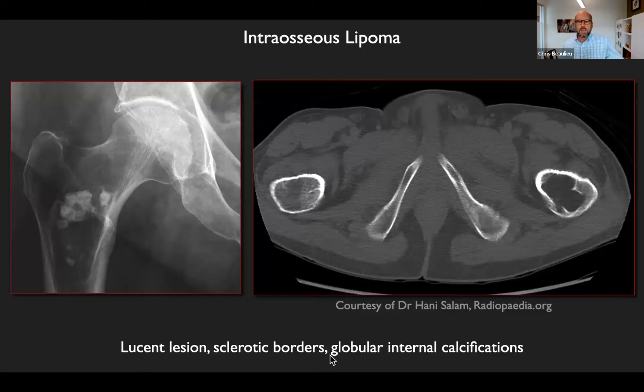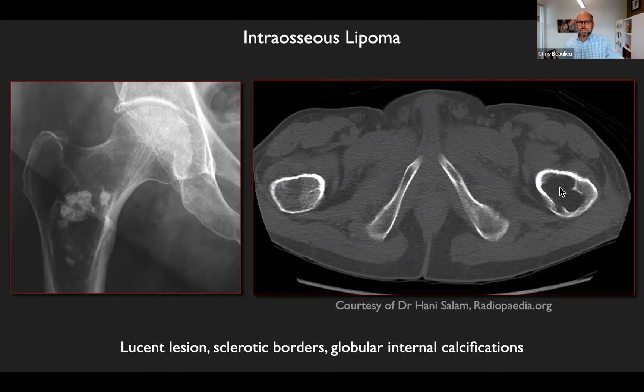Another finding you'll see is intraosseous lipomas, particularly in the femur. On radiograph there's a lucent lesion with sclerotic borders and rounded internal calcifications. On CT, a well-defined lesion occupying the trabeculae within the left femur compared to the normal right side, with internal density the same as fat. If you see fat in things, that's almost always going to be benign.